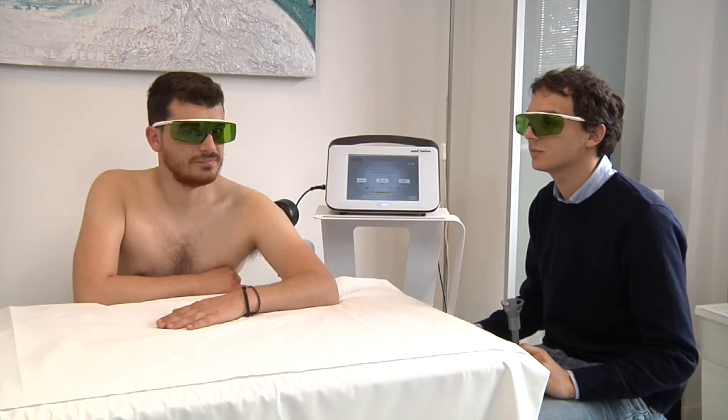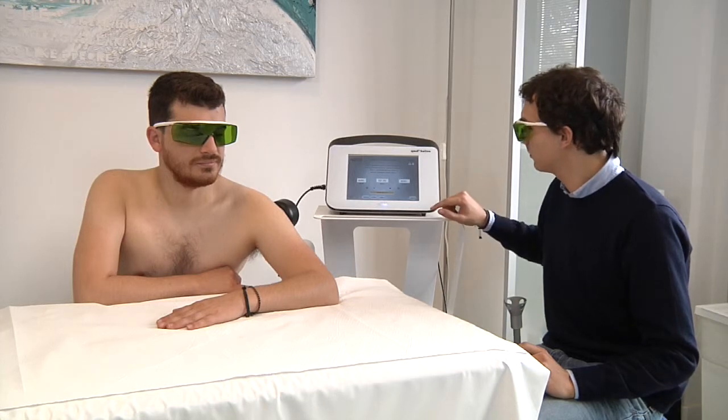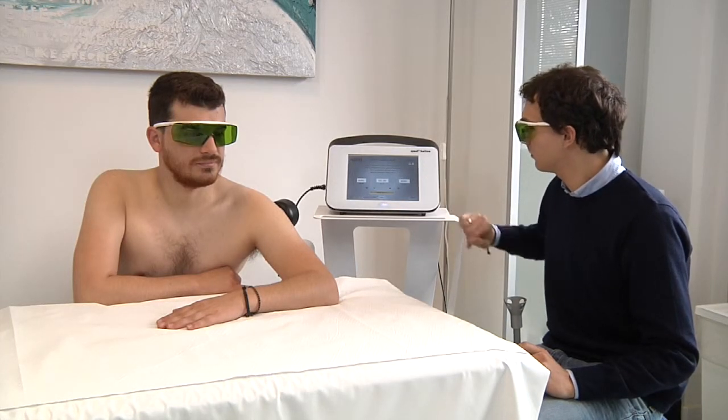For the fourth phase of treatment, we use the harmonic pulsation. We use the medium spacer. The treatment area is at the level of the myotendinous junction. The pointer must be kept fixed.